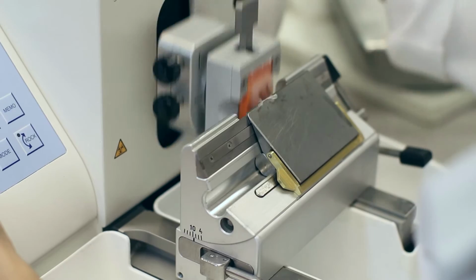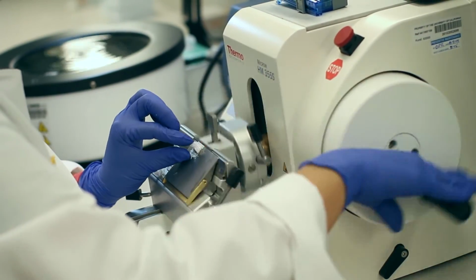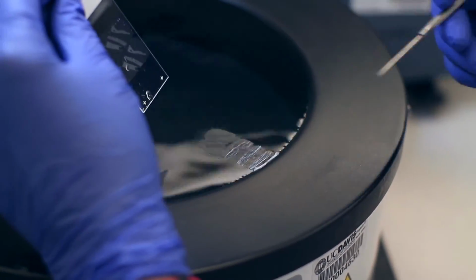Another service we have as part of research histology is called immunohistochemistry. That's a very powerful tool where you can look for certain protein markers and antigens in tissue. Our investigators use a lot of immunohistochemistry. We can perform that for them on samples that they provide, or if they want samples that are from the pathology department. That's actually a large part of our service and activity.